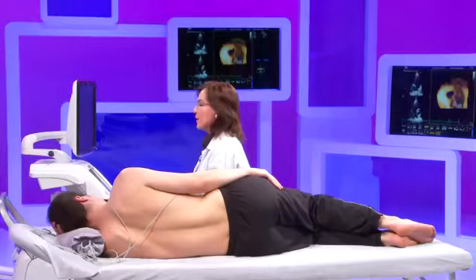If after all this comprehensive examination you are still having doubts about the severity, there is also the possibility to compare, by pulsed wave Doppler, the VTI, the velocity time integral, from the pulmonary valve and from the aorta.